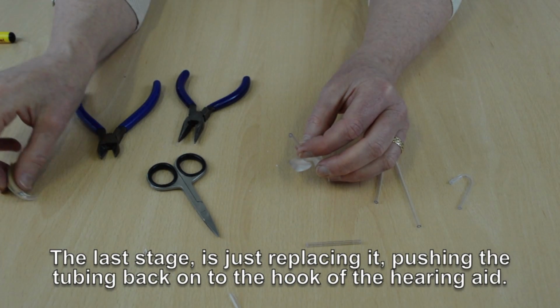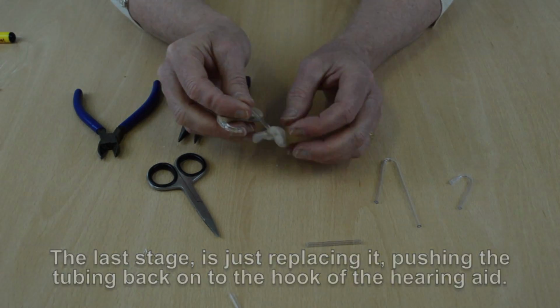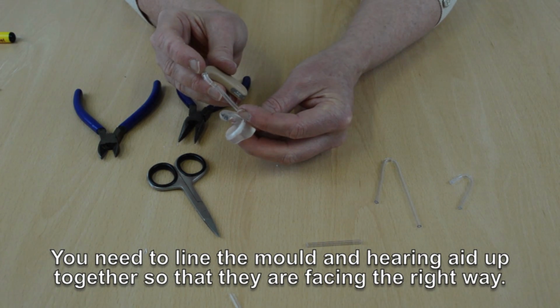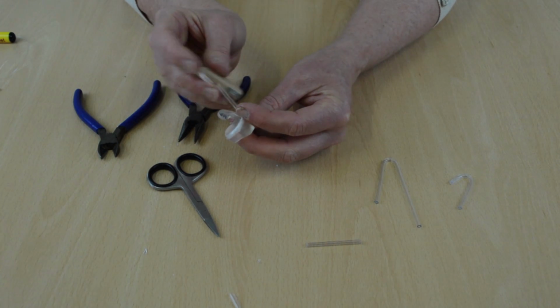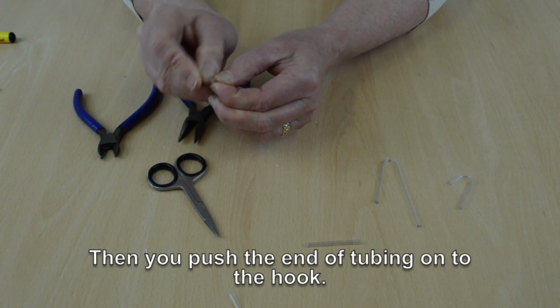The last stage is just replacing it, pushing the tubing back onto the hook of the hearing aid. And again, you need to line the hearing aid and the mould up together so they're facing the right direction. And then you push the end of the tubing onto the hook.